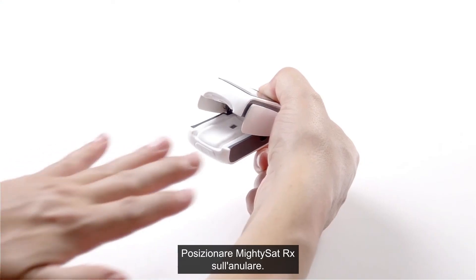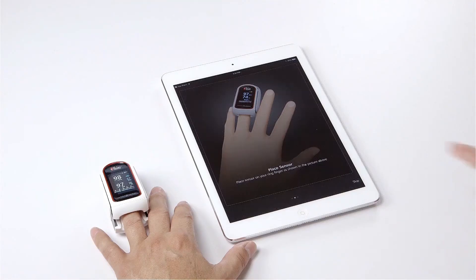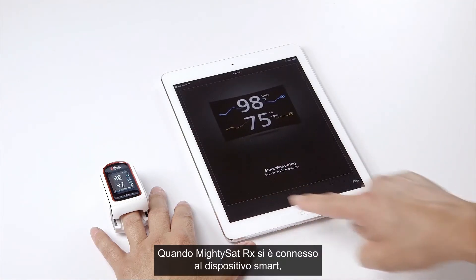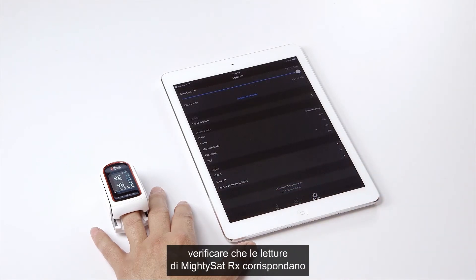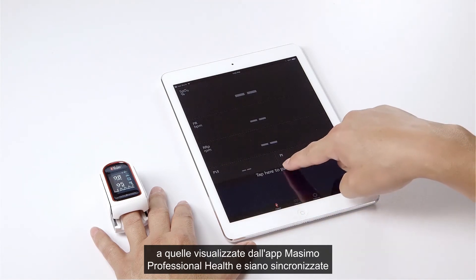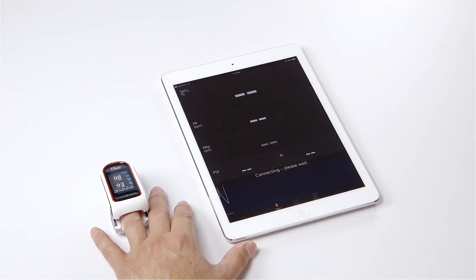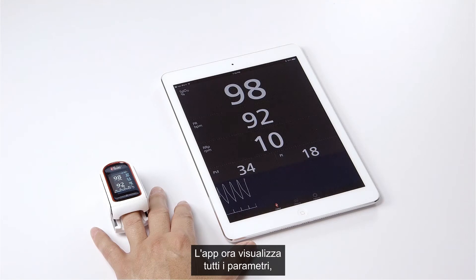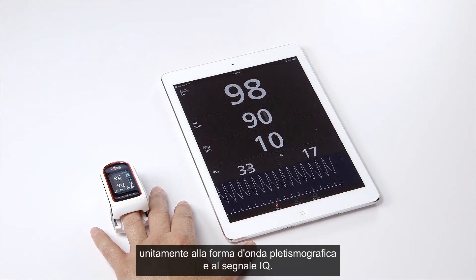Place the MightySat RX on your ring finger. Once connected to a smart device, confirm that the readings on the MightySat RX and the readings displayed on the Masimo Professional Health app are synchronized without a delay greater than 10 seconds. Your app will now display all parameters, including SpO2, PR, PI, RRP, and PVI, along with a plethysmographic waveform and Signal IQ.